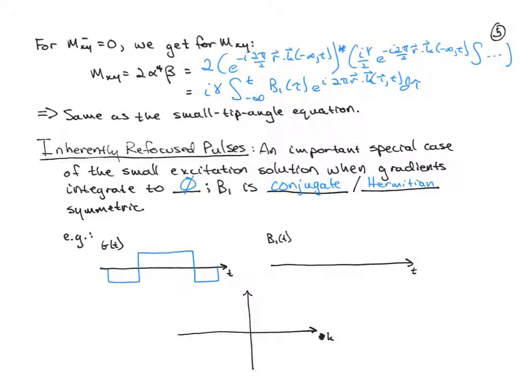So here, the negative lobes sum together to cancel out the main lobes, so you get 0 total area. And then the RF could be this split and mirrored waveform. Okay, so what we'd be doing here is starting in the center and moving negative. This would be segment 1, this is segment 2, and this is segment 3.